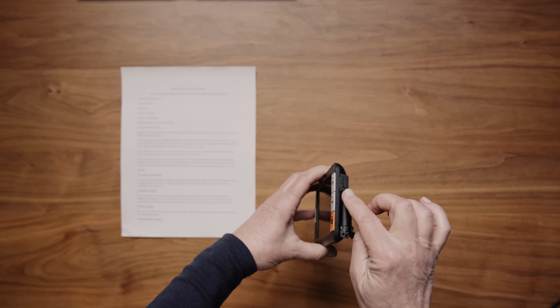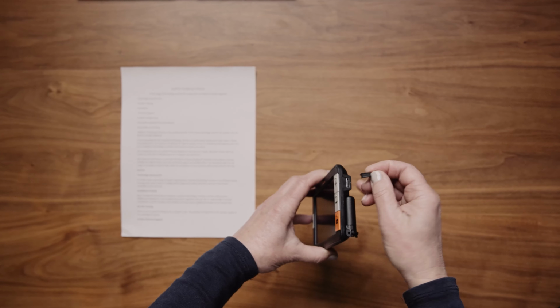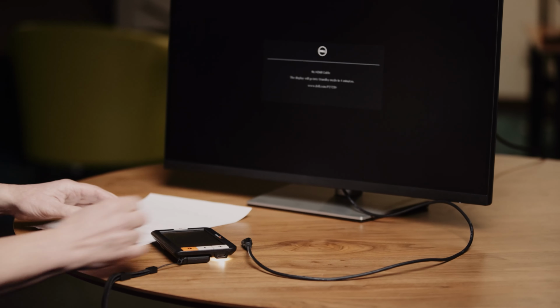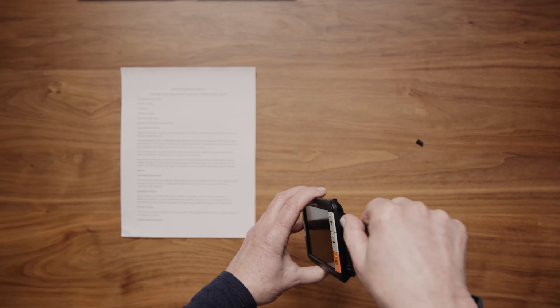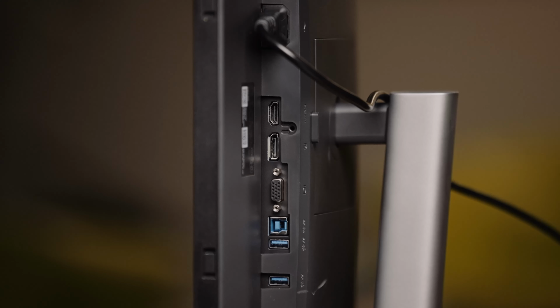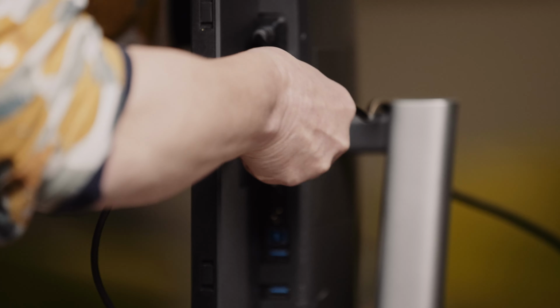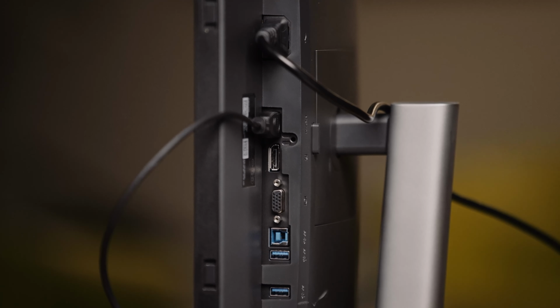1. Remove the high-resolution video output port's rubber cover, right side of the Explorer 5. Plug the smaller side of the cable into the Explorer 5 high-resolution video output port. 2. Connect the cable's larger-sized plug-in to an external screen. 3.